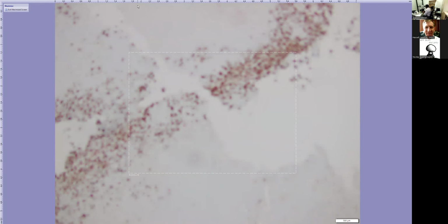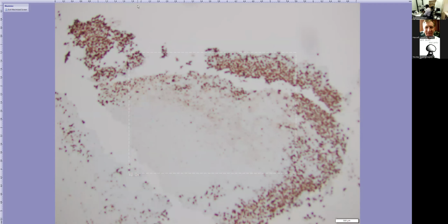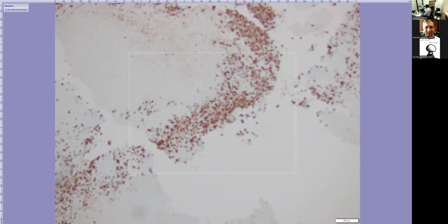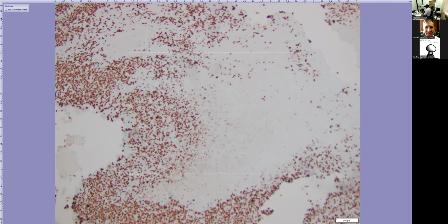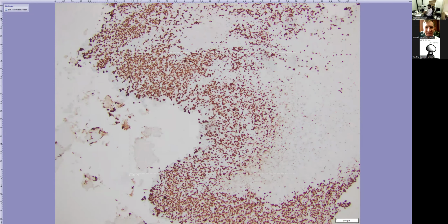And it was negative for cyclin D1, and Ki67, which is a marker of proliferation, was pretty high. You can see it's pretty much close to 90%. Morphologically, we saw a lot of mitotic figures and apoptosis, so this is not a surprise. So high Ki67, large B-cell lymphoma.